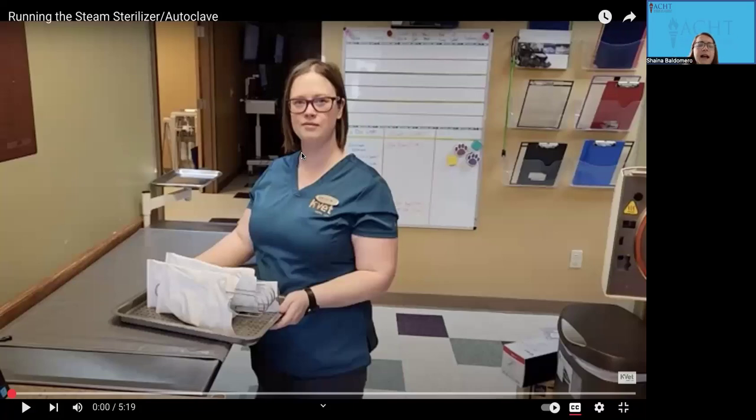Depending on your campus, you might have a more old school version of an autoclave. They all work the same. It's just having to do more manual settings on your older ones versus automatic settings on your newer ones. Regardless, your hospital will train you on how to enter the settings for your sterilizer, but you should know everything up to that point. You should know how to make the packs, place them in there, make the pouches, label them, get them all ready. And then again, they will teach you what their specific machine calls for and the procedures.